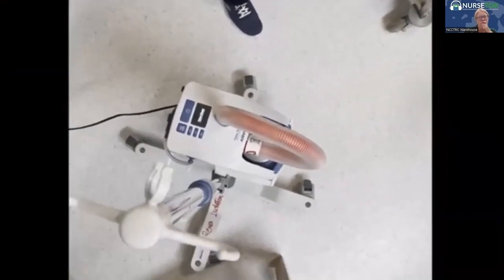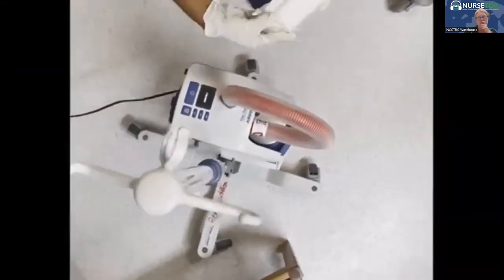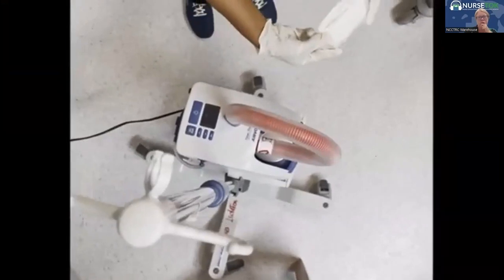Again, if the air filter needs changing, the machine will promptly advise. If there are other prompts, notify the biomed while the machine is being disinfected.